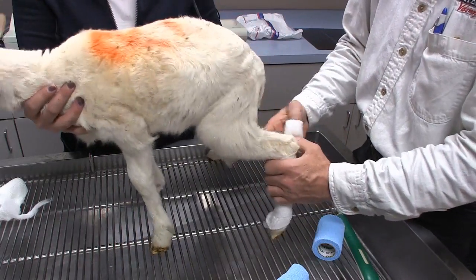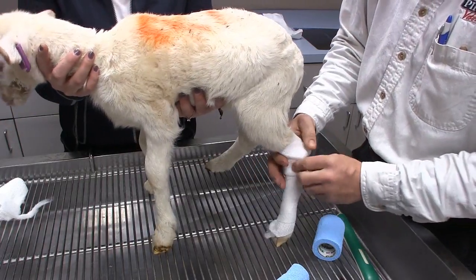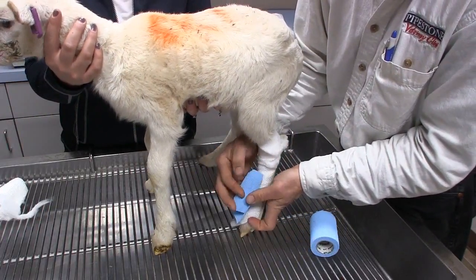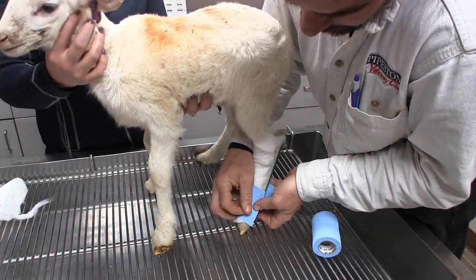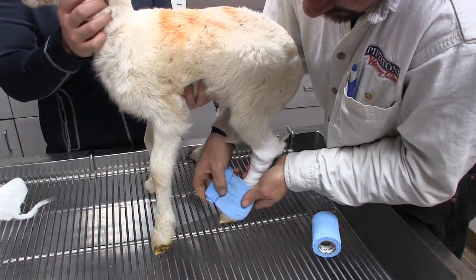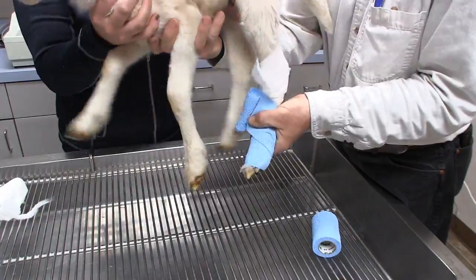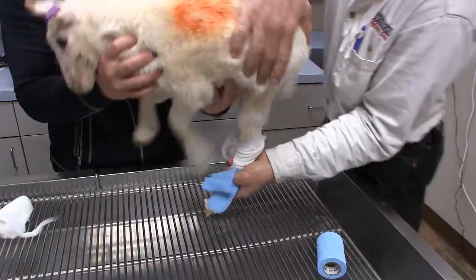This third video segment is to show how to splint a hind limb, so this would be for a fracture below the hock. Again, we're going to pad the skin with cast padding, apply a green splint, and then we'll use the vet wrap to try to immobilize the joint above and below, similar to the front leg. So we're going to start out down at the bottom of the foot. We're actually going to leave just a little bit of skin exposed. We don't want this real tight because we don't want it to cause a tourniquet. At the same time, it needs to be tense enough to have rigid fixation.